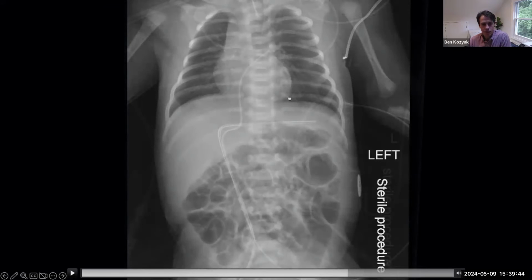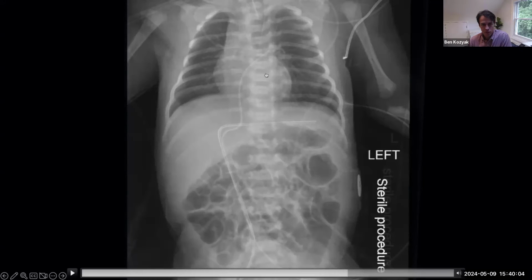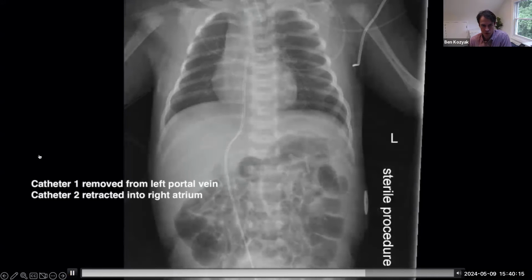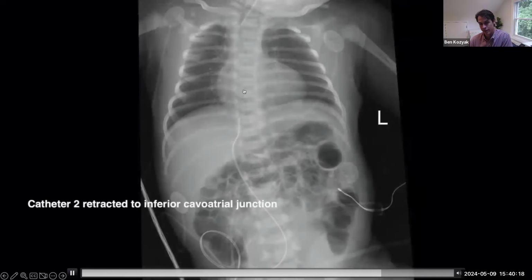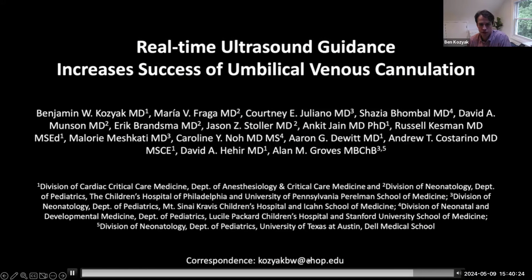I know that the radiograph is a little bit comical, but we deliberately left one catheter probably in the left atrium and one catheter way off in the liver. We did that on purpose because we knew that when we tried to retract one catheter, we might drag out the hard-won properly positioned line as well. And so we left them deliberately deep at first, separated them on the belly to be absolutely sure we knew which one was which, and then pulled out the first one, which did drag the second one back a little bit, and then repositioned the second one to where we wanted it in the low RA.